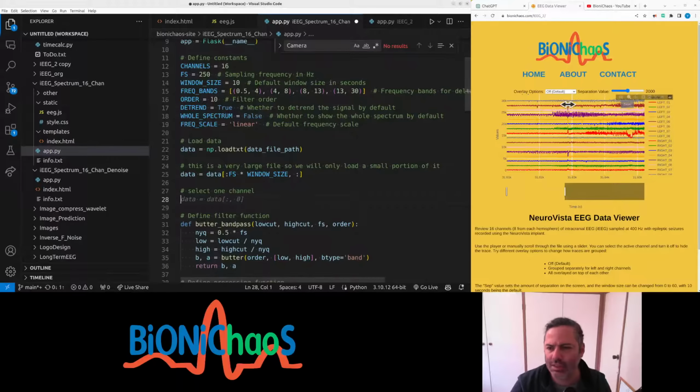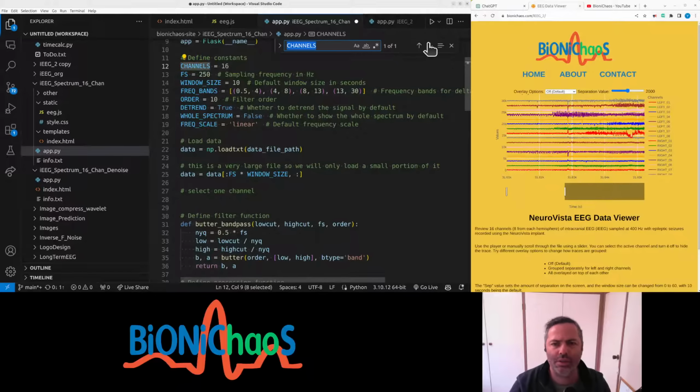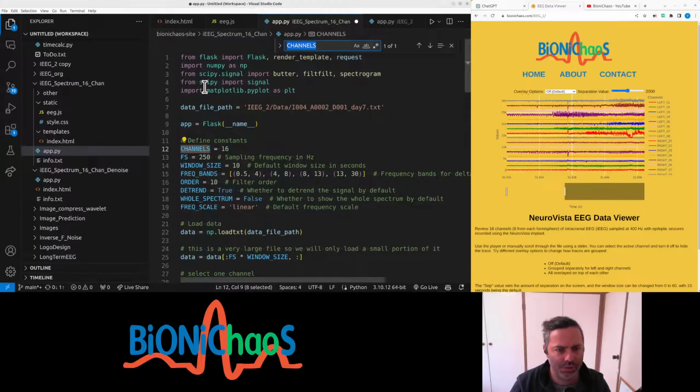Eventually the selected channel will be coming from the web application. But currently, are we using it? We are not using it. Yeah, we do have 16 channels.